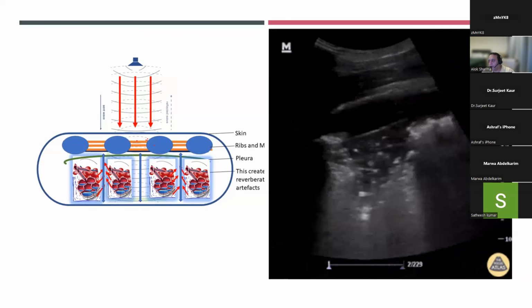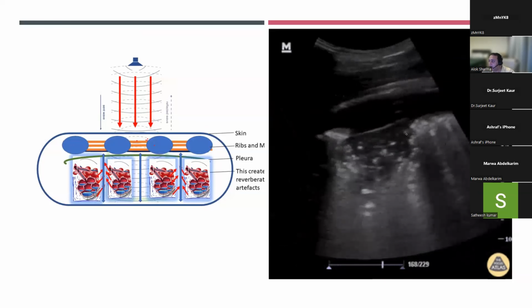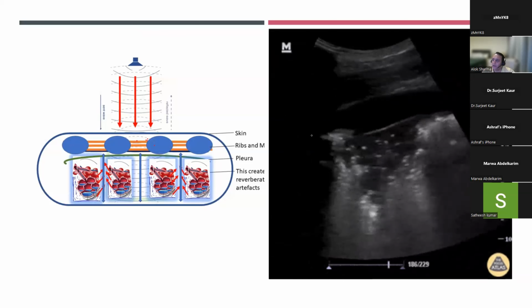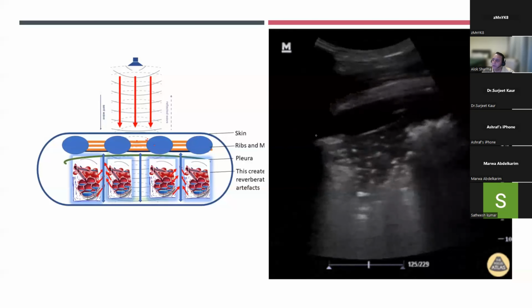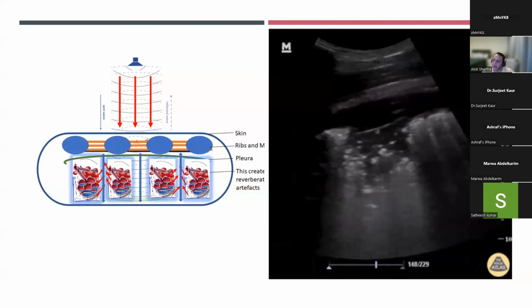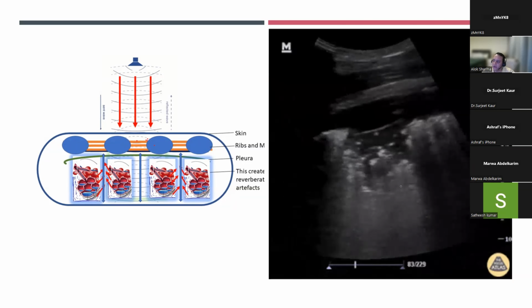So if you look at the consolidation over here, consolidation is an area like this. It's a mnemonic kind of clinical presentation. Take my word for it, based on clinical correlation. Now you have pleura. This is parietal. This is visceral pleura. And you basically have lung that's compressed. But what has happened over here is you've got an infective process that's destroyed lung tissue. Now, because it's destroyed lung tissue, air can't get into this area.